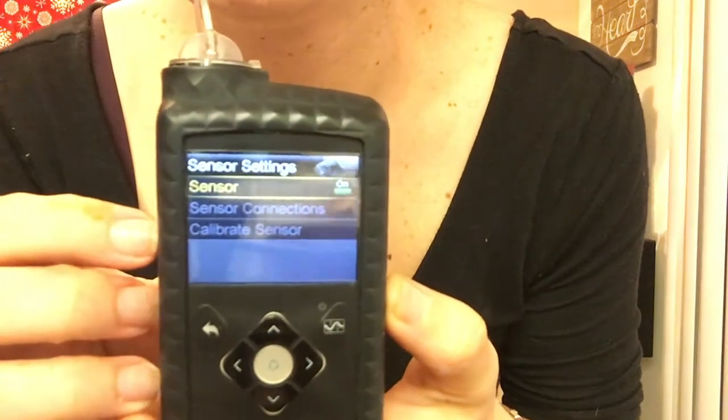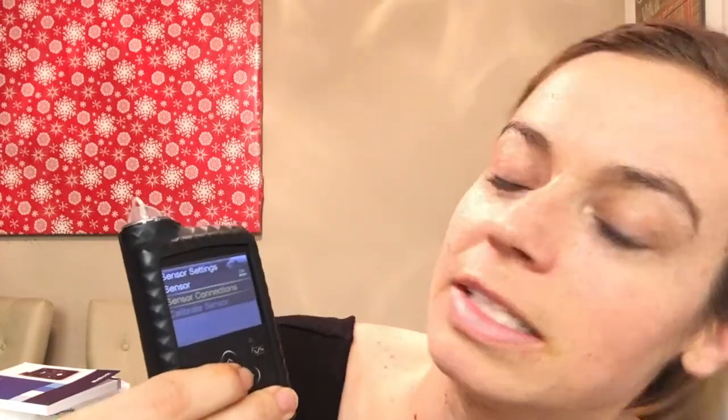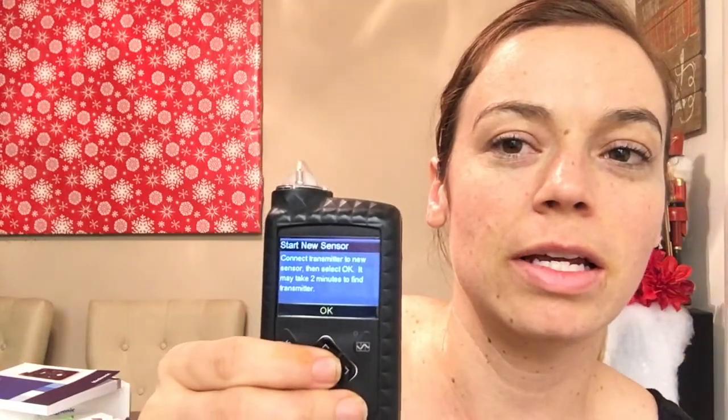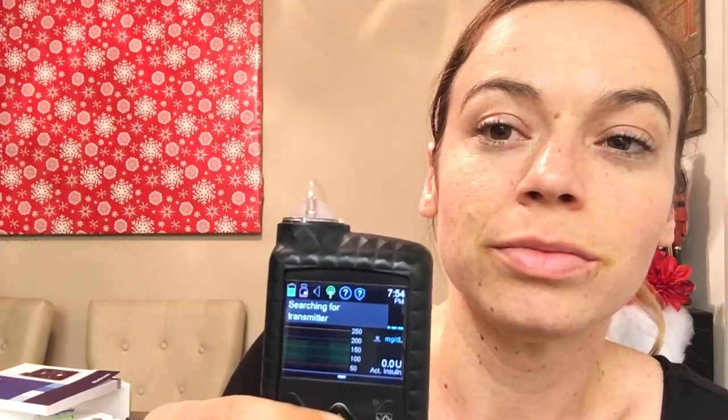I'm having technical difficulties — I have it on but for some reason I can't calibrate it, so let me figure out what I'm doing. Okay, I completely skipped a whole step. I was supposed to go through the system user guide and sync it to my pump — I was a little excited. We have now got it connected and the sensor is on. Click on sensor connections, start new sensor — it says 'connect transmitter to new sensor,' select okay. It may take two minutes to find, so press okay. It's searching for a transmitter right now.